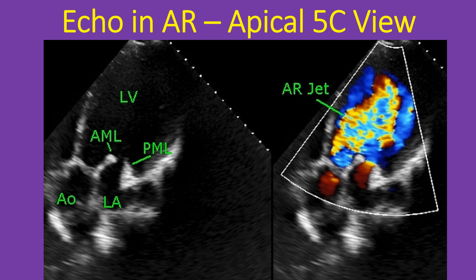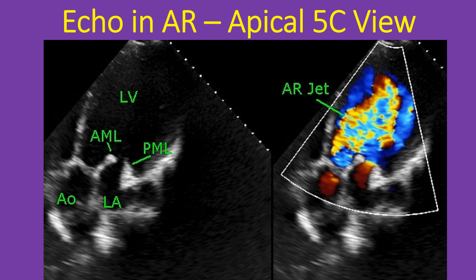Thickening of both aortic and mitral leaflets indicates the possible etiology as rheumatic. Mitral and aortic valves are the most often involved valves in rheumatic heart disease, the former being more common between the two. When there is associated mitral stenosis, the color Doppler jet of mitral flow merges with that of aortic regurgitation in the left ventricle, as both occur in diastole. However, the velocity of the aortic regurgitation jet is much higher than that of mitral stenosis, as the pressure difference between aorta and left ventricle in diastole is much higher than that between left atrium and left ventricle.